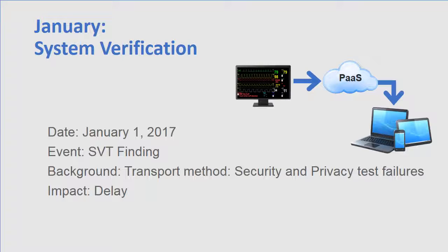But there has been a 4-month delay in deploying the modified system, and something else also happened. Because the team was backed into a corner and changed to a wired PC connection, the mobility and usability of the monitor has been compromised. This team learns that for many reasons, designing a software or a device layer between the medical device and the cloud is a best practice.